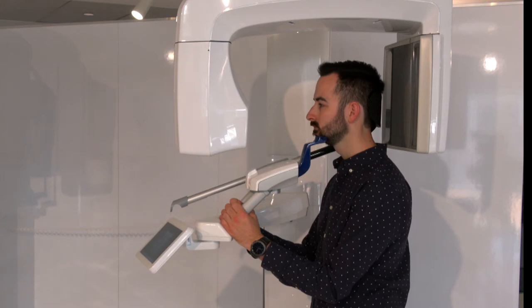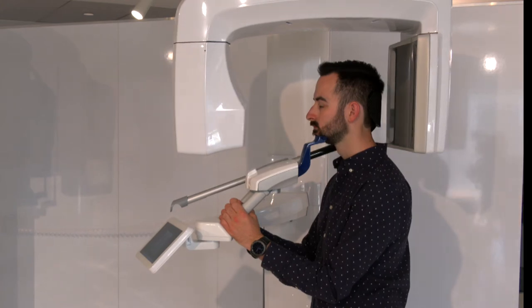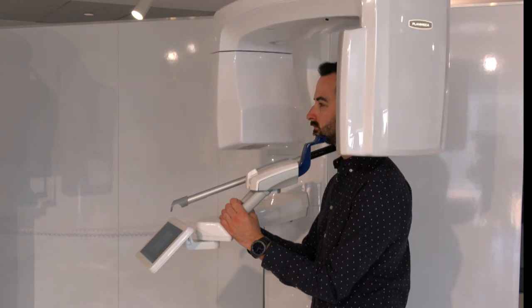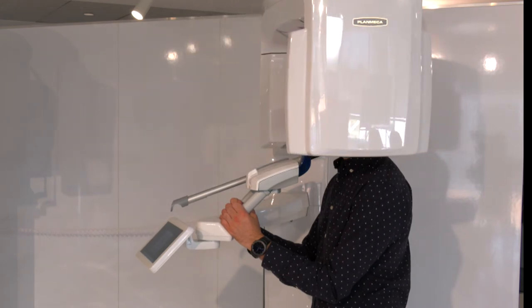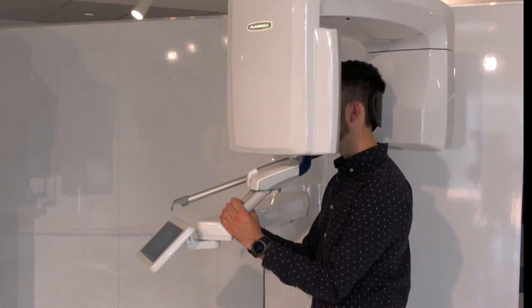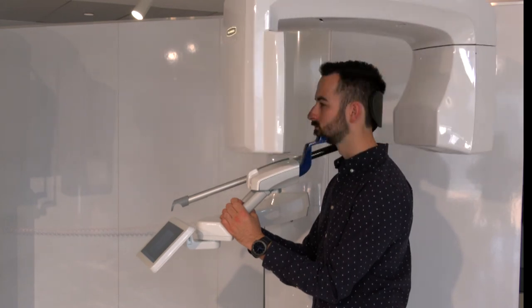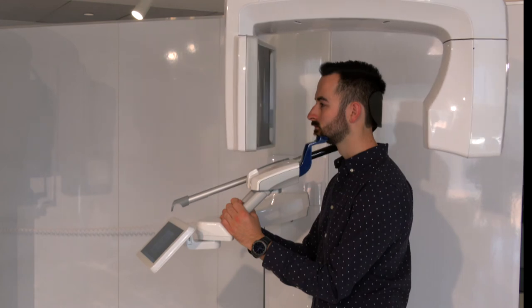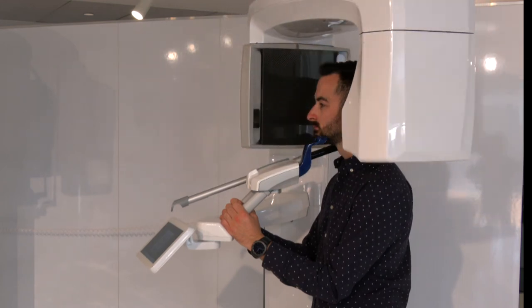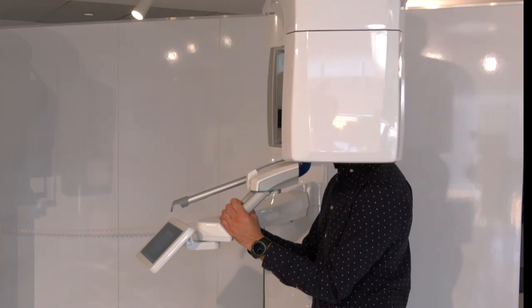Now, while the model is 3D printing, we usually take a CBCT. In this case, we're using the VISO. If you don't know, the VISO is a remarkable system with augmented reality patient positioning, where you can see the patient's face live on the screen and just select the area that you want to expose. So there's really no guesswork when you're trying to expose the patient. It's been a game changer.